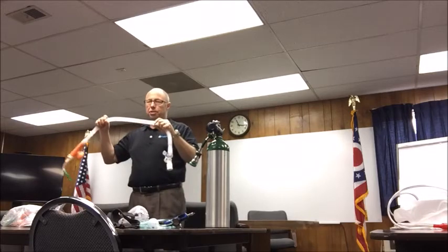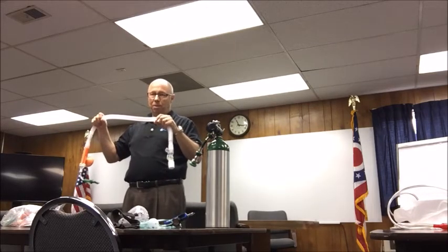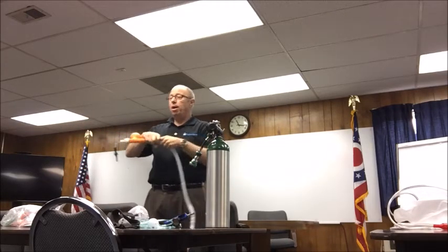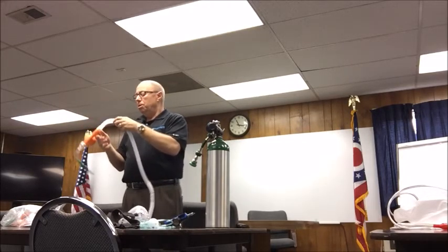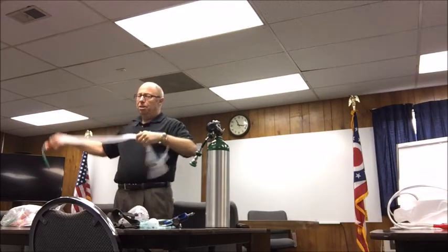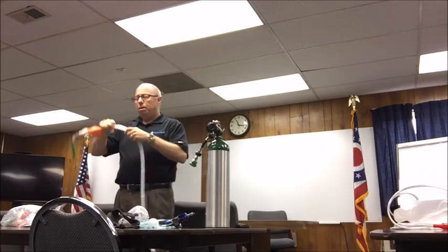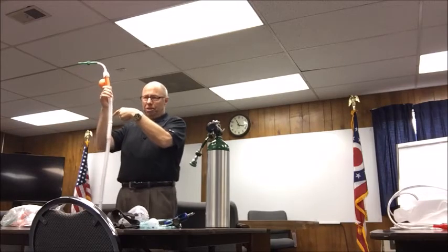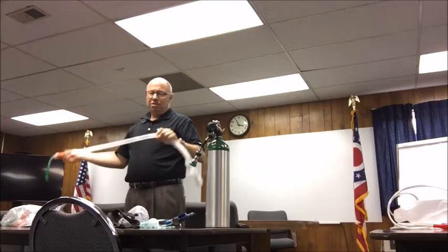This will stretch to 6 feet or 72 inches. It does not have to be opened all the way for it to work. It doesn't have to be opened at all. One of the things that we hear every once in a while, it makes a whistle. Every once in a while you get a patient where it makes a whistle. So if you'll keep this collapsed about 3, 4, 5 inches here and pull from this side, it will stop that whistling. The reason why it's whistling, it's coming at 140 liters per minute. It's just turbulating through that corrugation, and that's what creates the whistle. It does not affect the efficacy of this system.